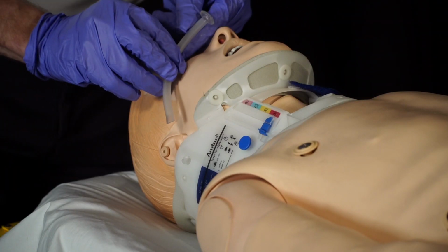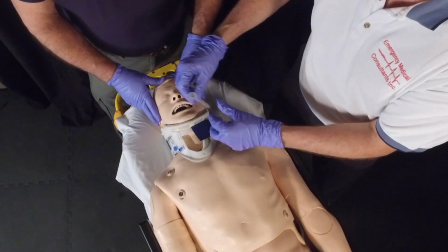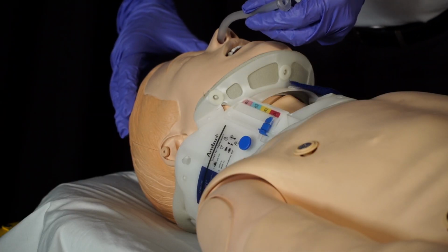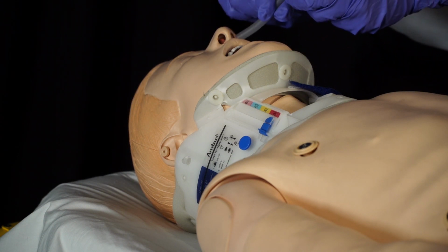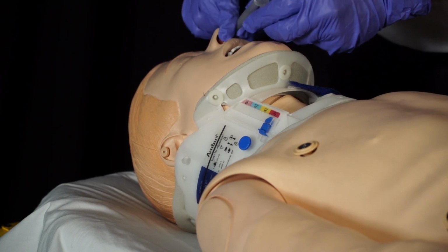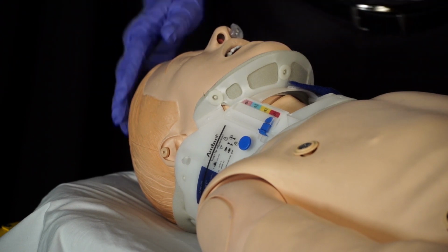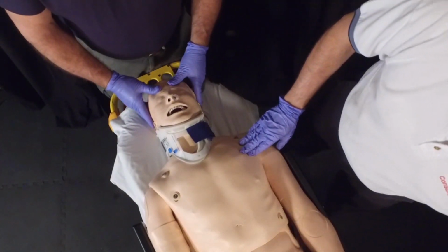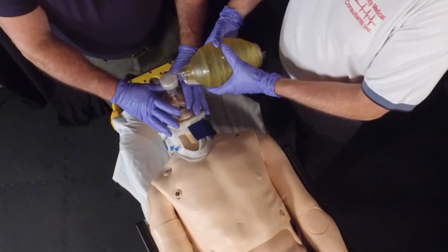So we measure this from the earlobe, or the angle of the jaw, to the tip of the nose. The bevel is designed to go towards the septum, so they're designed to go into the right naris. If for some reason you're unable to pass it in the right naris and you have to put it in the left naris, remember that you have to turn the device backwards so that the bevel is towards the septum, and then when you reach the back of the throat, or the posterior pharynx, rotate it around so that this is going to go down the back of the throat. So now this is keeping the tongue out of the posterior pharynx, and we can ventilate, if need be, as we were.